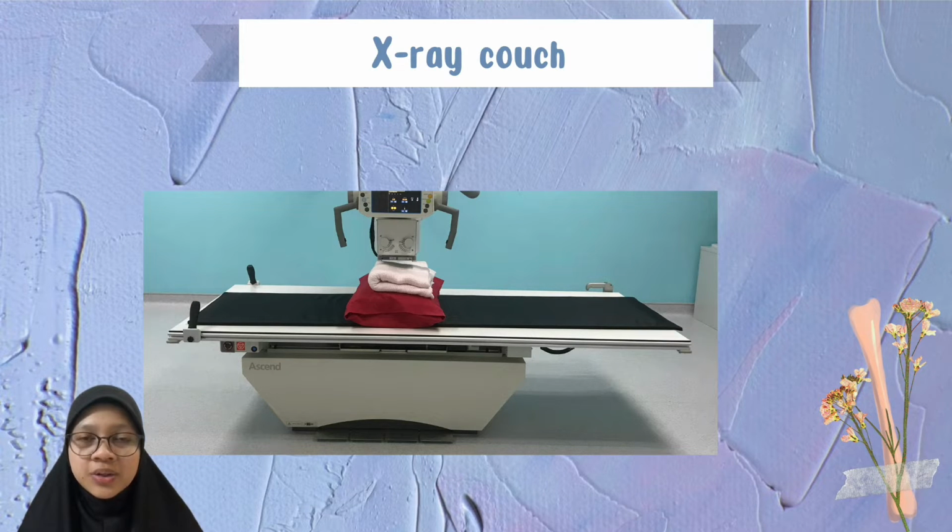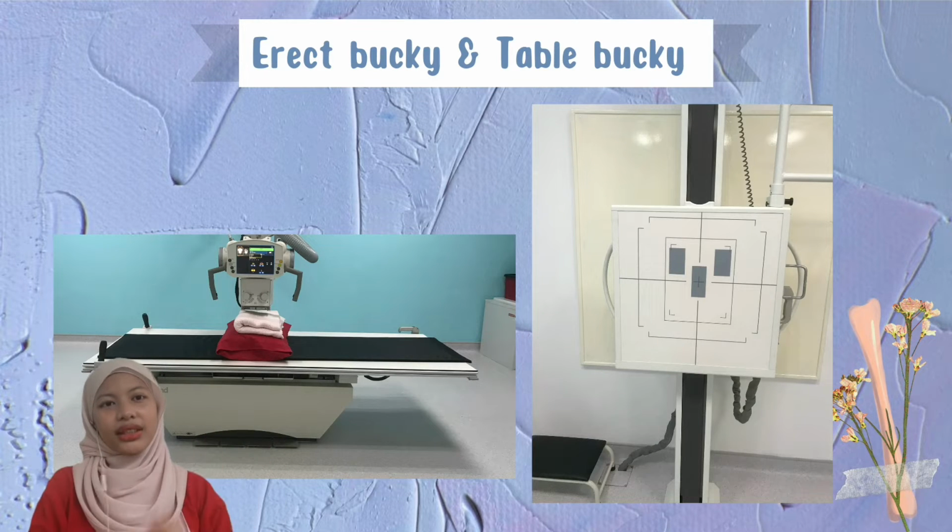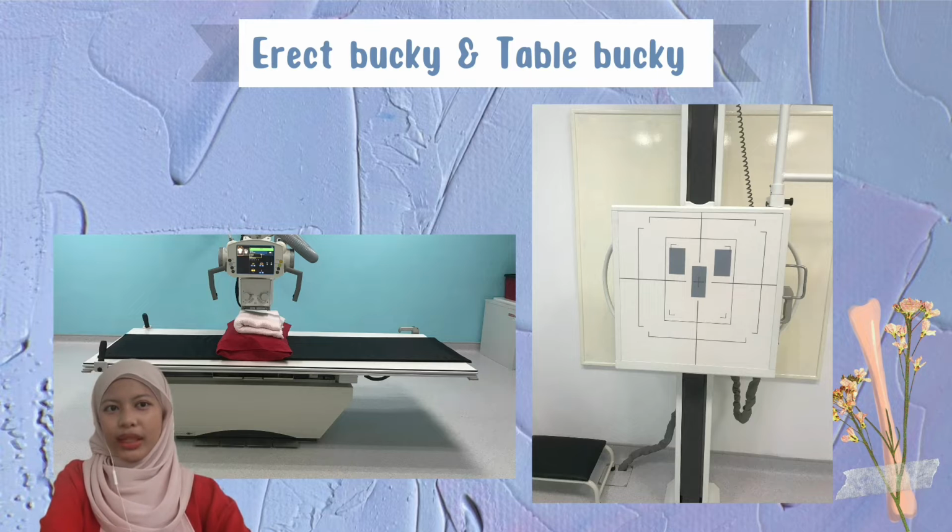Moving to the X-ray couch. The X-ray couch, also known as the patient table, is a platform where the patient lies during the procedure. Other than that, the X-ray couch can be moved upward and downward, also outward and inward, by stepping on the pedals. So, what is the function of the erect bucky and table bucky?